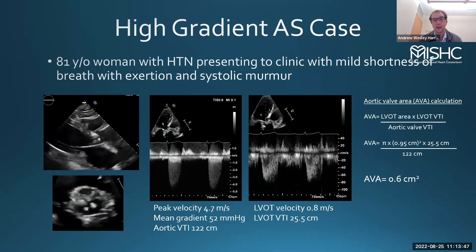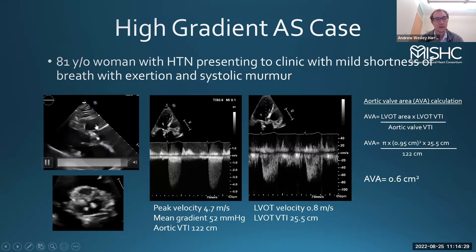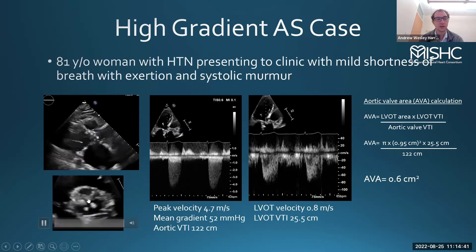Here's a case: an 81-year-old woman with hypertension presenting with mild shortness of breath on exertion and a known systolic murmur. On echo, the left ventricle is squeezing well with normal function and a little hypertrophy. The aortic valve is very calcified and doesn't move well at all. From a short-axis view, it's a heavily calcified structure with very restricted motion.